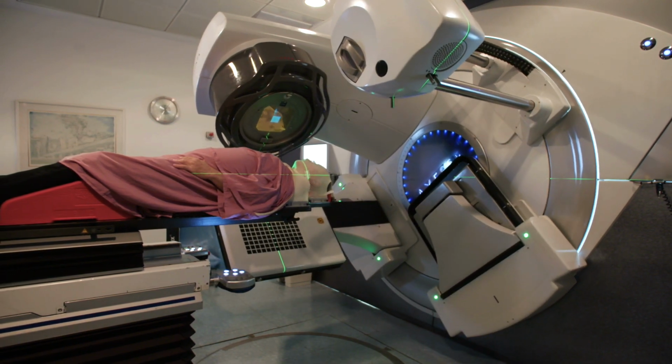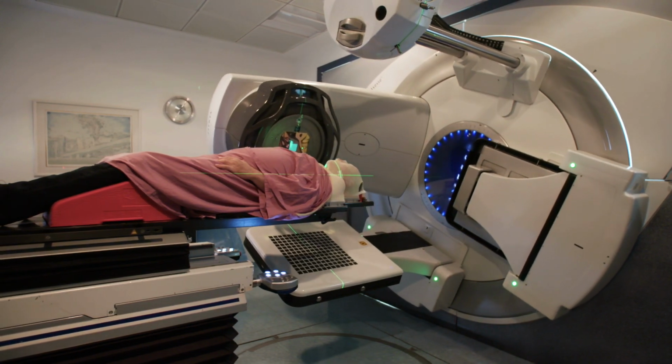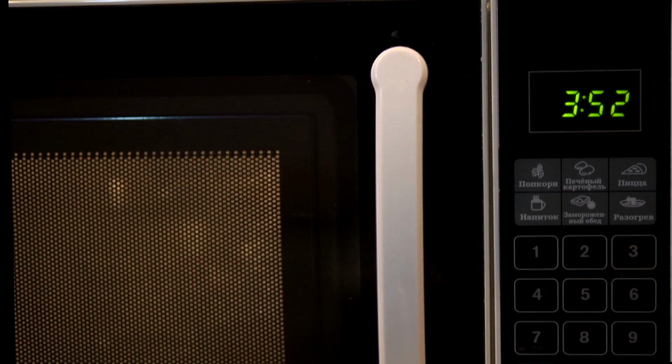Another question that comes up is the question about radiation. So let's talk about the three different studies and what that means. An X-ray and a CT scan are really relying on radiation, like a microwave, right, emits radiation. An X-ray is a different type of radiation than a microwave, but it's using radiation to basically take a photograph of the bones, right? An X-ray is doing that, and a CT scan is doing that in more detail. Remember, we said a CT scan is more of a 3-dimensional picture, and so as you might imagine, there's more radiation involved with a CT scan.